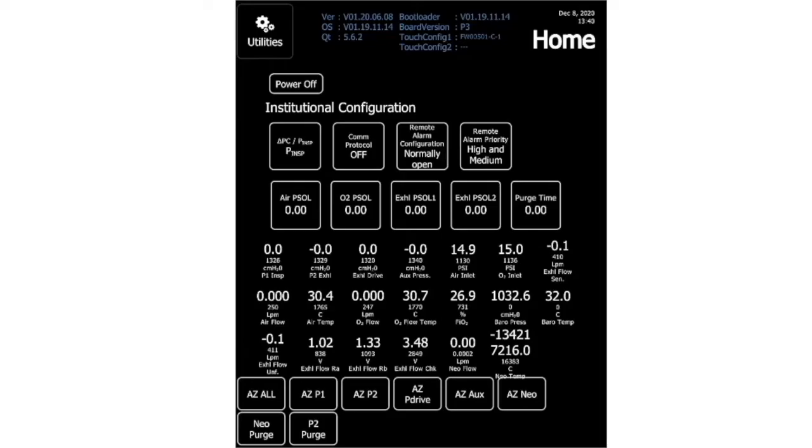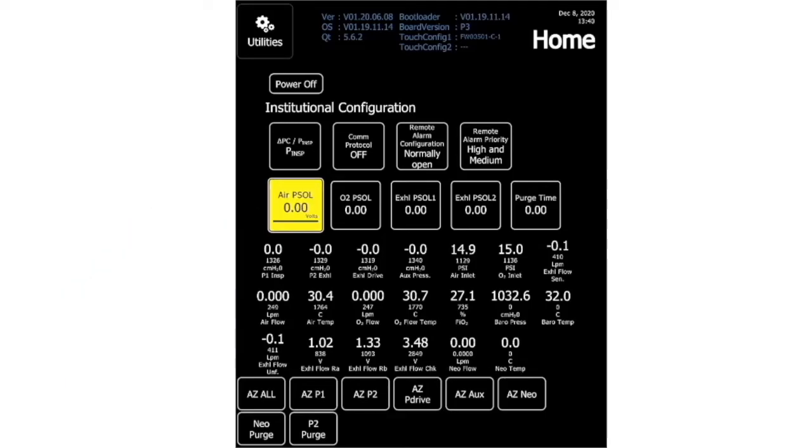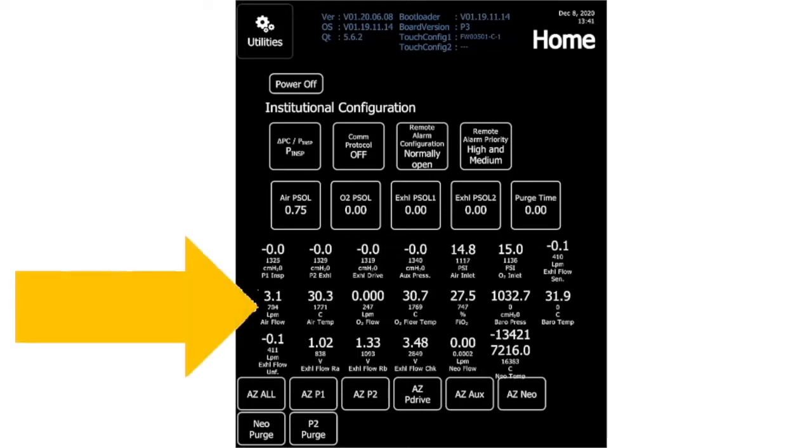The first step is to select the air PSOL button. I then want to use my encoder knob to adjust this to create a flow of 3 liters per minute, plus or minus 1. On the vent, it doesn't take much voltage, and I'm going to turn it up to approximately 0.7 or 0.75, and let's see what value that gives us for a measured airflow. This generated an airflow of 3.1, so I'm going to keep my setting here.